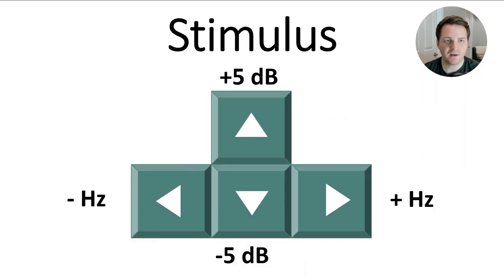The stimulus can be adjusted using the arrow keys. The up and down arrow keys affect the stimulus level by raising it 5 or decreasing it by 5 dB at a time. The left and right arrows decrease and increase the frequency of the stimulus.